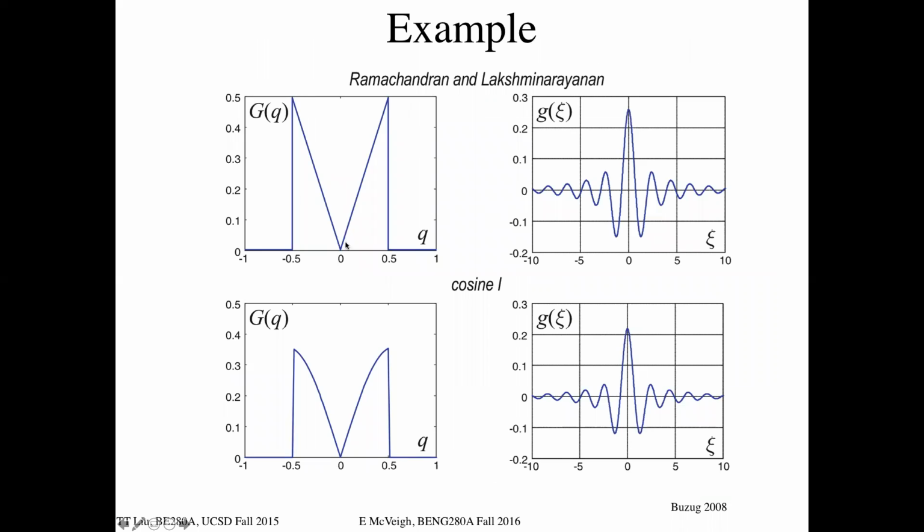So that is called the Ram-Lak filter in convolution back projection. And that is the fundamental filter that will give you the actual object. It's the highest degree of accuracy to reconstruct that object for the brightnesses as a function of position. The unfortunate part is if you use this filter, while it's accurate, it amplifies a lot of noise.